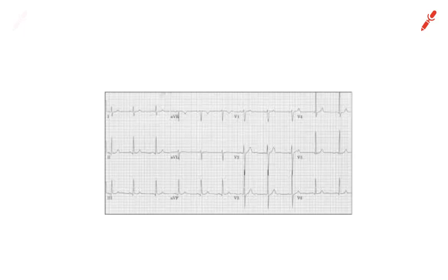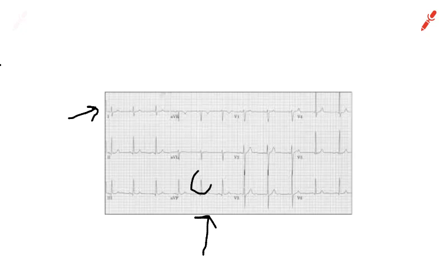You're looking at Lead 1 and Lead AVF, and what you want to look for is the highest deflection. The book probably says you look for the R wave — you want to see if it's positive or negative — but really you're looking for the highest deflection. In this example, you can definitely tell that the R wave is a lot more positive. In Lead 1's case, the biggest deflection is positive — it's slightly more positive than it is negative, so this up is slightly higher than it is down.